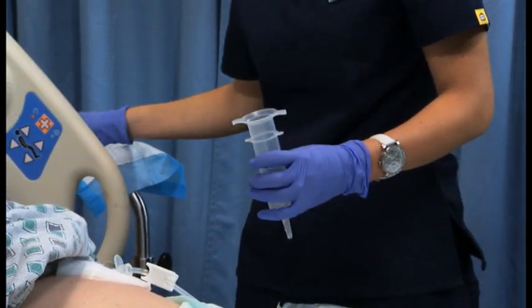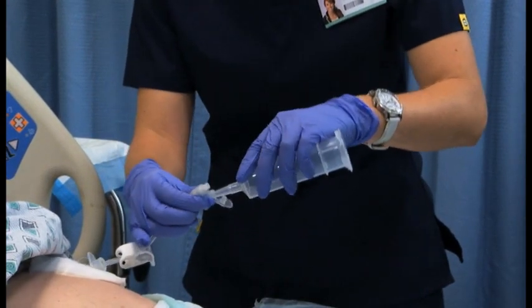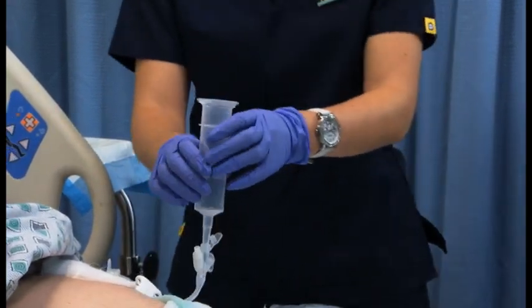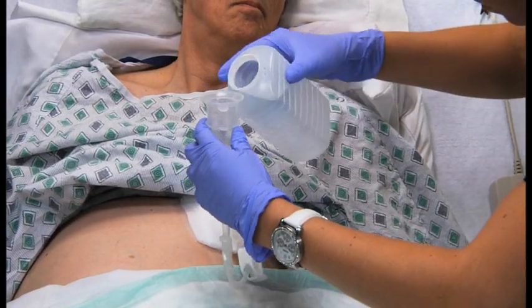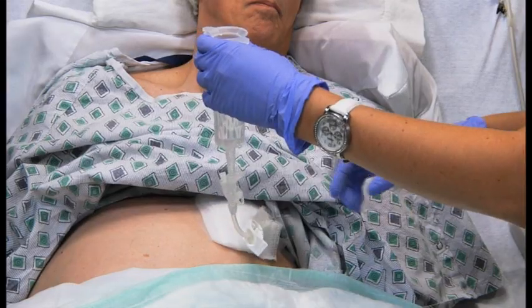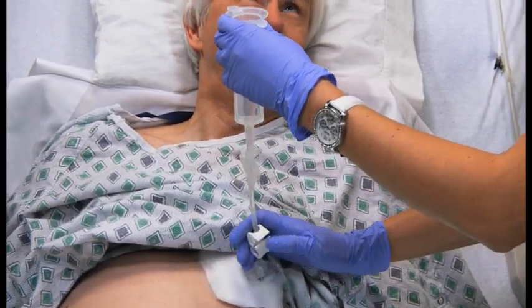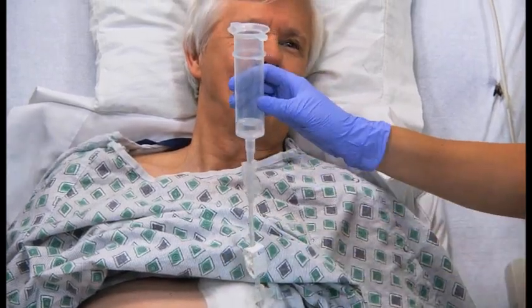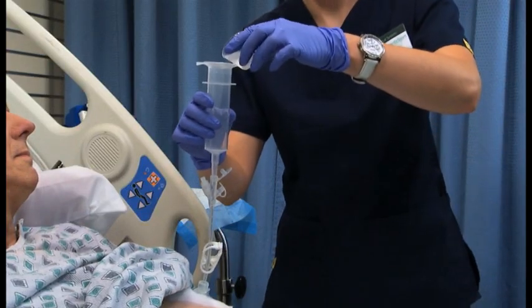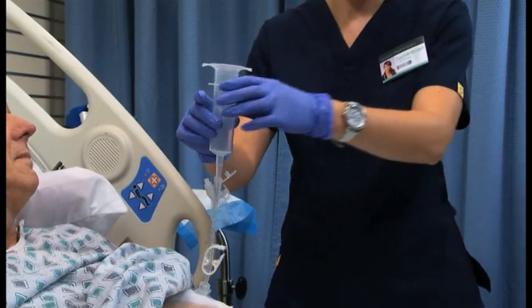Reinsert the syringe in the gastric tube without the plunger. And pour 30 milliliters of water into the syringe. Now I unclamp the tube and let water enter the stomach via gravity infusion. Next, you administer the first dose of medication by pouring into the syringe. Okay. Good. Now, clamp the tube.